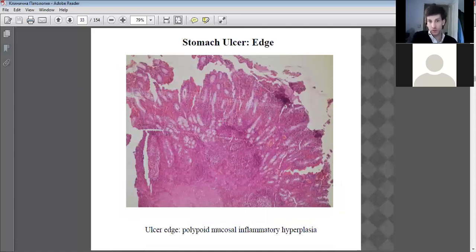The edge of the ulcer has been magnified for us, and we can see the total breakdown, particularly because it's a rough border, it's become very rough. See the destruction of the pits, the various pits. Yeah, there's once a gastric pit there. There's once an example one, but it's broken mostly down. This one is almost finished, broken away.